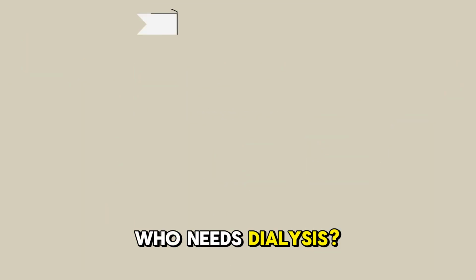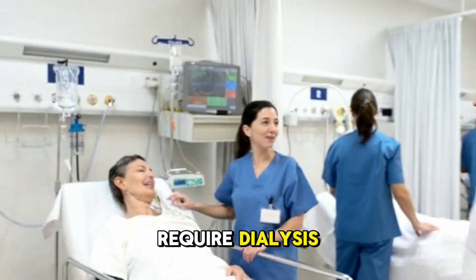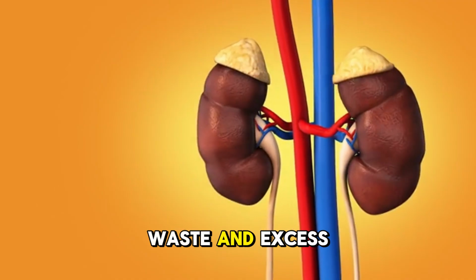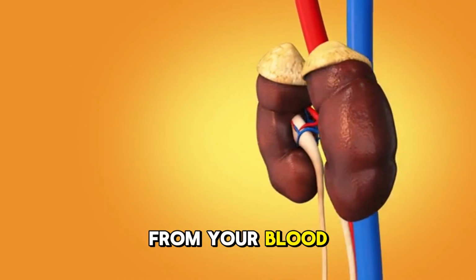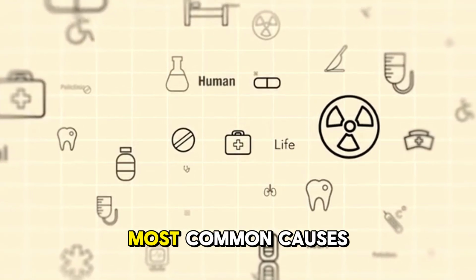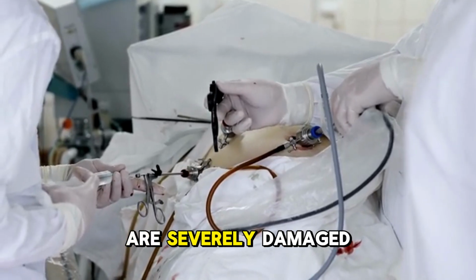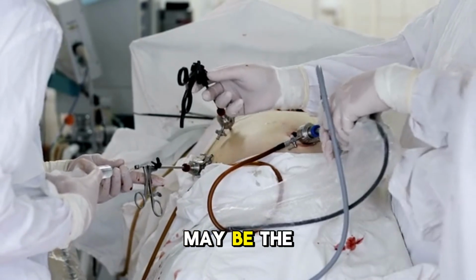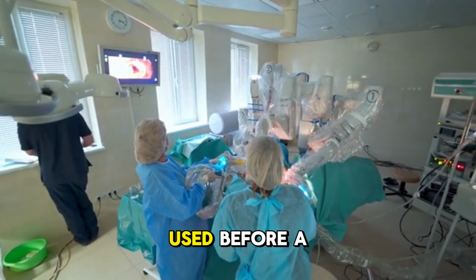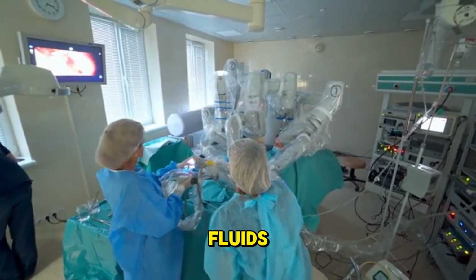Who needs dialysis? People who have kidney failure require dialysis. Kidney failure occurs when your kidneys lose the ability to remove waste and excess fluids from your blood. Chronic kidney disease, diabetes, and high blood pressure are the most common causes of kidney failure. If your kidneys are severely damaged, dialysis may be the only way to keep you alive. Dialysis can also be used before a kidney transplant to help your body get rid of waste and extra fluids.